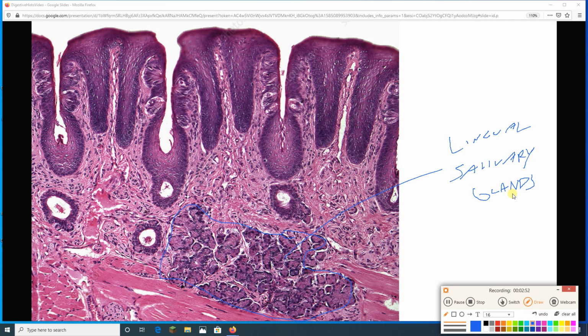They're responsible for basically the all-the-time saliva, not the saliva that we associate with being hungry or with eating. That's more the product of your extrinsic salivary glands, which we met last time when we did digestive gross anatomy, and I'm talking about parotid, submandibular, and sublingual there. All right. What else do we see? We see several ducts for salivary glands as well. These are all lingual salivary gland ducts. Nice cross sections of them.